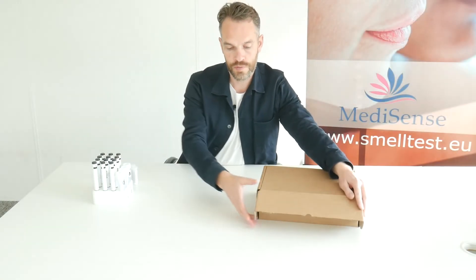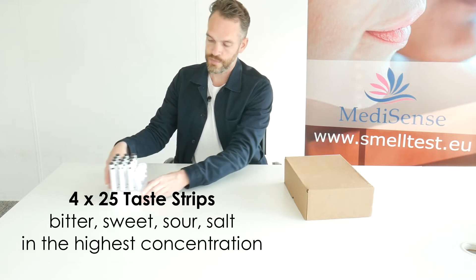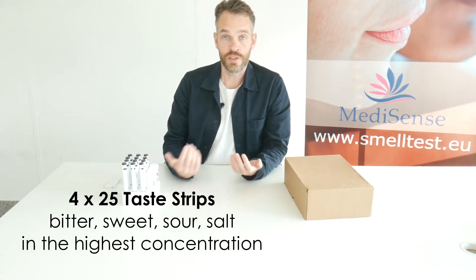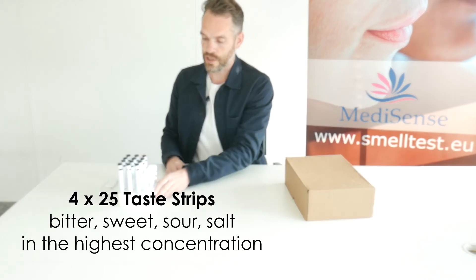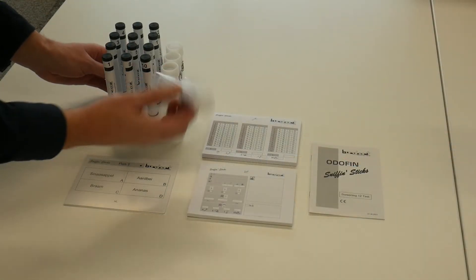Another option is to use four tastes but only in the highest concentration — so sour, bitter, sweet and salt in the highest concentration. I have those taste strips here, which are part of the Screening 12 smell test.